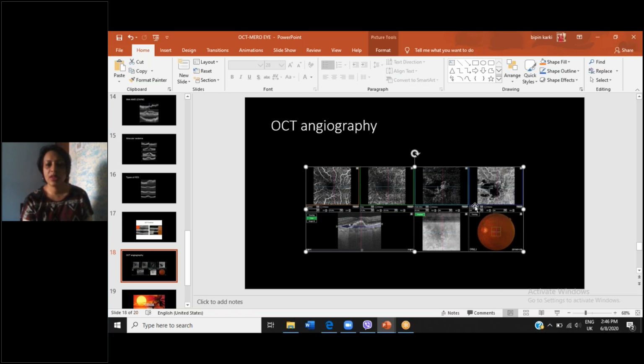However, these two layers, the RPE layer and then the layer of the photoreceptors, there's invasion into that layer, into the photoreceptor layer by the choroidal neovascular membrane. So that's what happens in wet macular degeneration, and that's very clearly visible. And when we slice the retina at that level, this is what we get, and this is what is seen in wet macular degeneration.